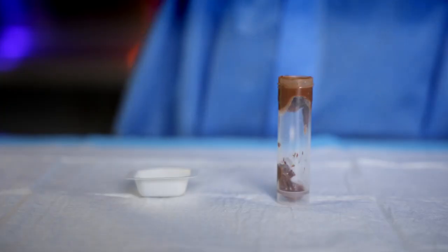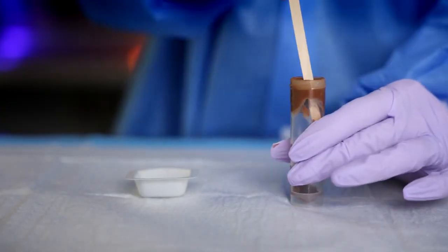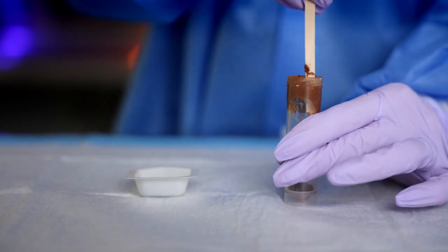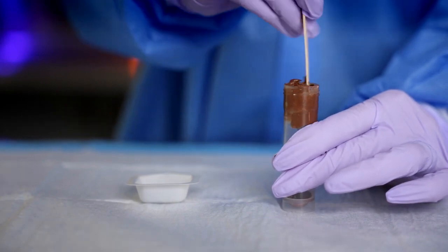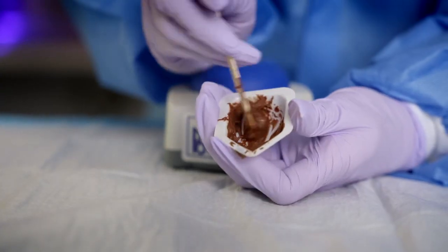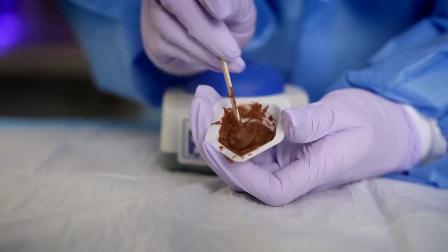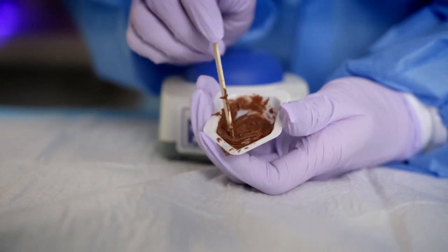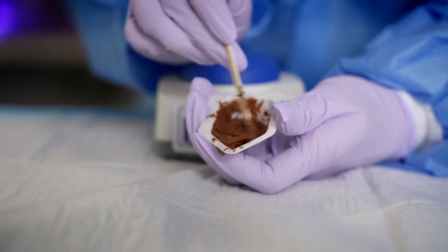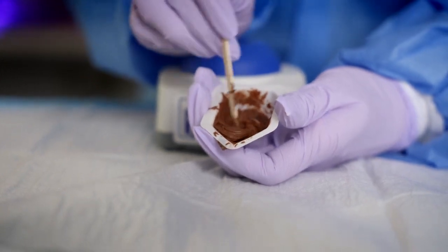Before sampling the stool with the dosing pin, the stool should be homogenized with a wooden stick or an inoculation loop as best as possible prior to sampling. Stool is a heterogeneous sample and calprotectin is not found uniformly throughout the sample. Therefore, it is imperative to mix the sample as best as possible prior to sampling. If a sample has been received frozen, please make sure the sample has completely thawed and mix it thoroughly so as to avoid the water pooling at the top.